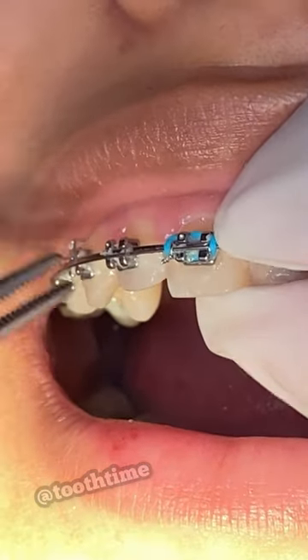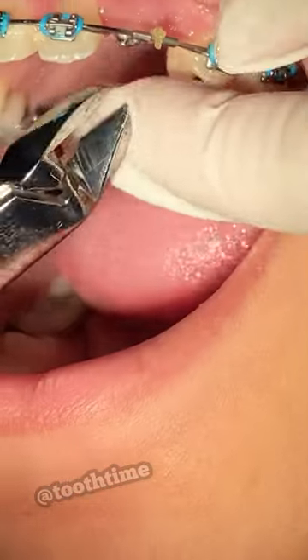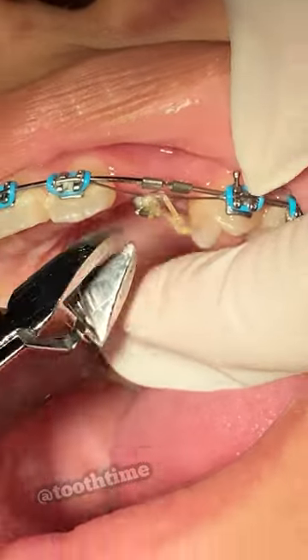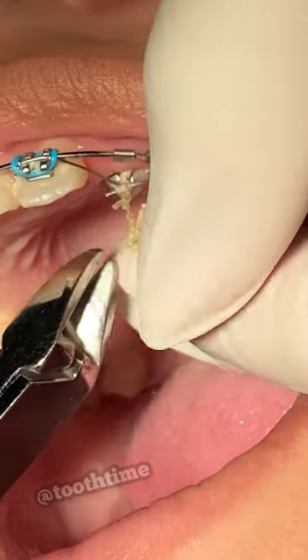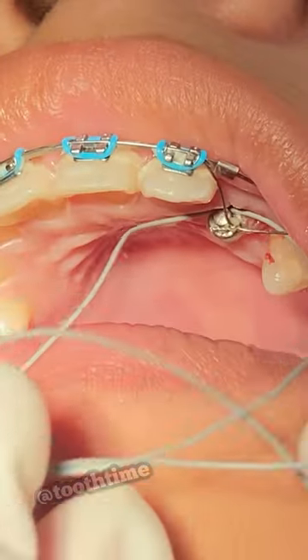This patient came in with an impacted tooth, which is the upper left three — what you all know as the vampire tooth. What has to be done in this case is to try to bring the tooth down, so the tooth has to be exposed, meaning just kind of laser off some of the gingiva.